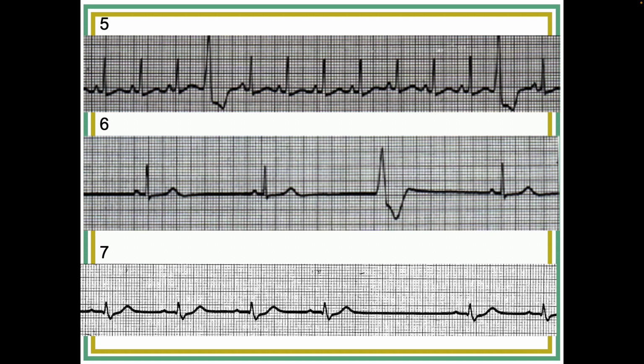Okay, so Riley, you're next, and this one is sort of irritating, but do your best. Yeah, I'm working it out as we speak. Let's see. So these are calipers going from R wave to R wave. Even though the third QRS looks super wonky, it's consistent as far as timing. It comes in right on time.